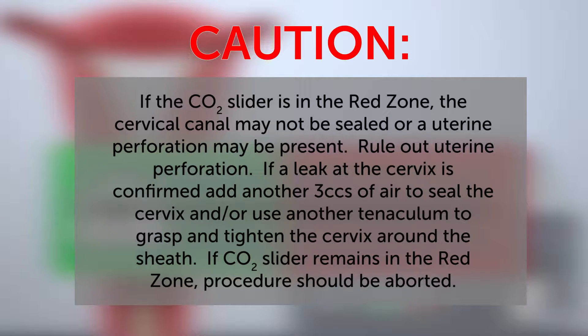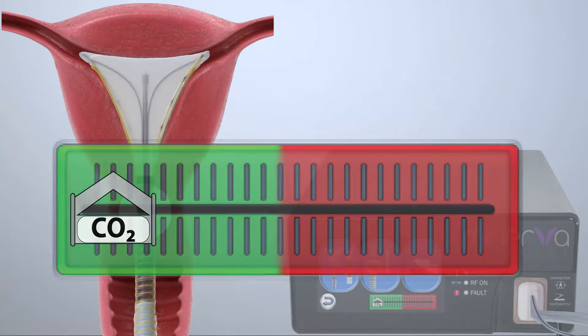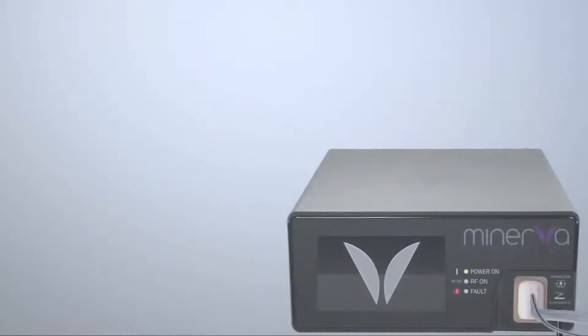Rule out uterine perforation. If a leak at the cervix is confirmed, add another 3 cc's of air to seal the cervix and/or use another tenaculum to grasp and tighten the cervix around the sheath. If the CO2 slider remains in the red zone, the procedure should be aborted. After confirming the CO2 slider is in the green zone, tap the footswitch to initiate the two-stage uterine integrity test.